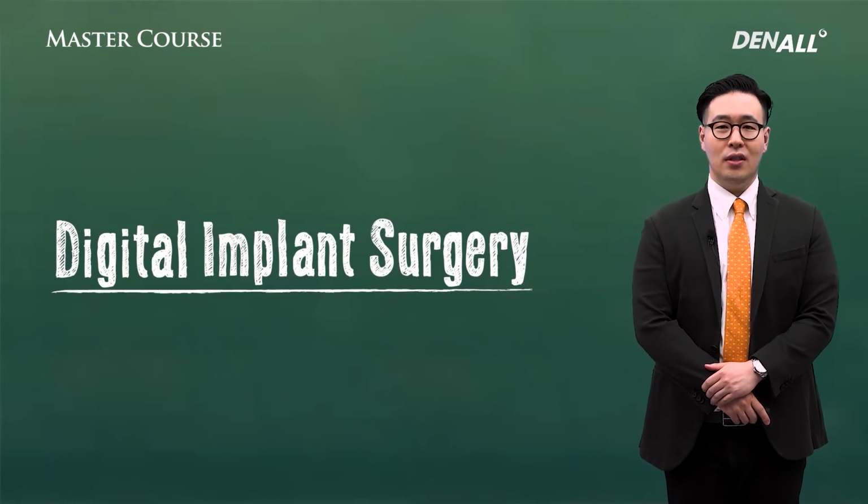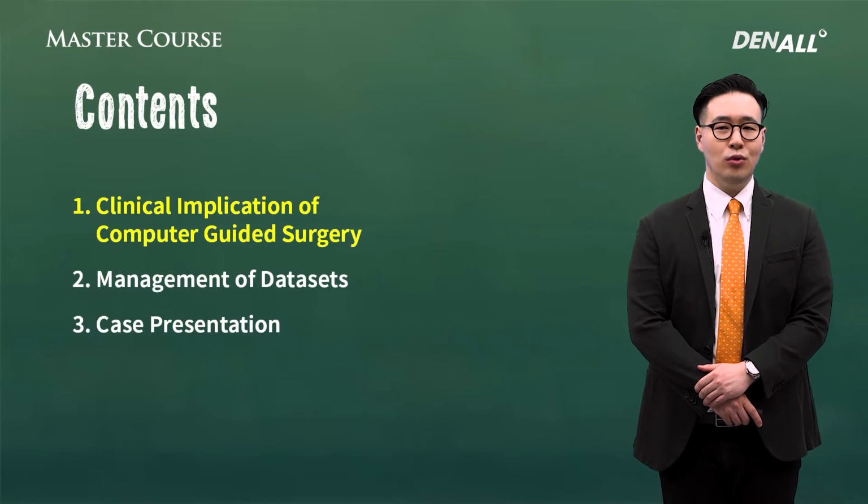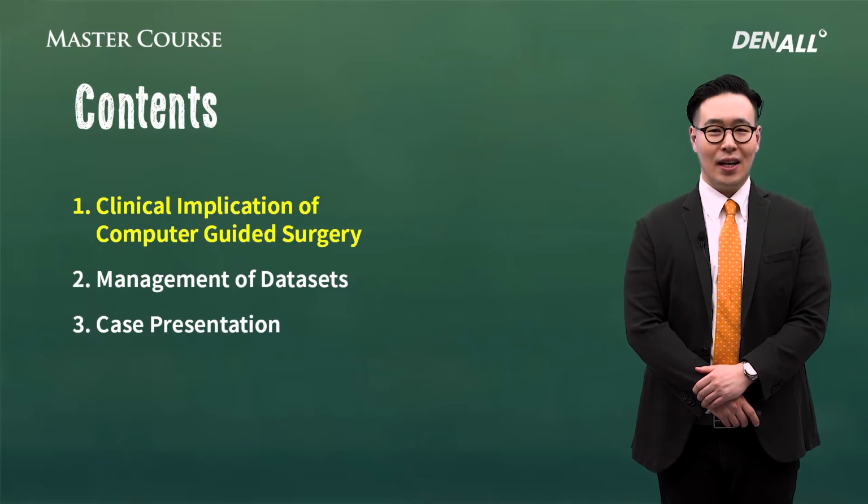Digital implant surgery is widely used. That means a guided template is used during the surgery. Why is it getting so popular? Let's look at some of the reasons why.